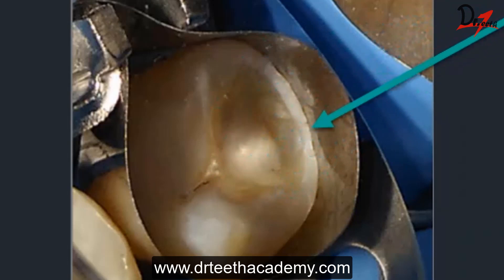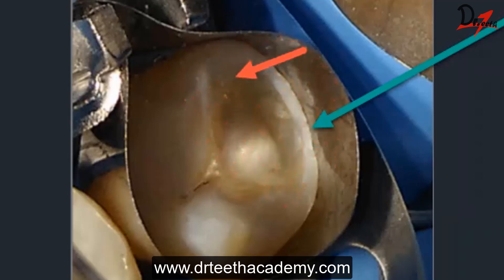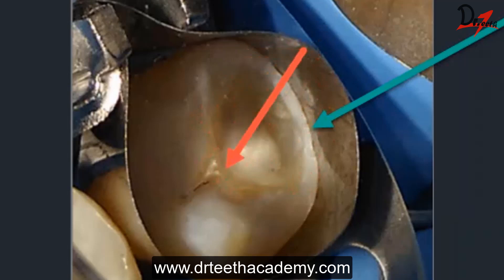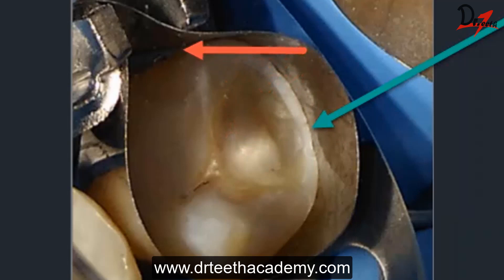One important point about bonding agent application: many times we are in such a hurry — especially when isolation is not ideal and we worry about saliva contamination — that we rush the bonding agent application. You should not hurry. Take your time, apply the bonding agent and massage it onto the tooth surface properly, letting the primer penetrate all the porosities created during acid etching. Once that is done, air-thin it, then apply a second coat. Applying two coats ensures a proper strong bond, as a single coat can leave voids.